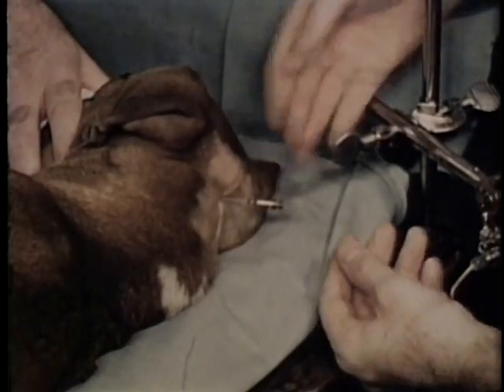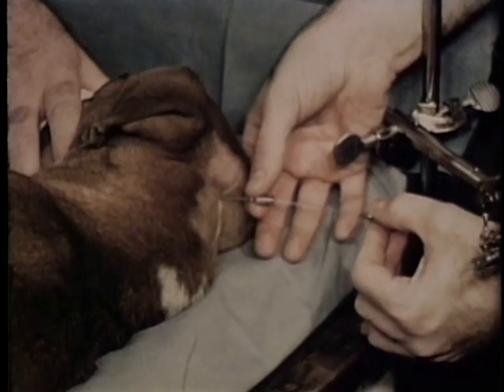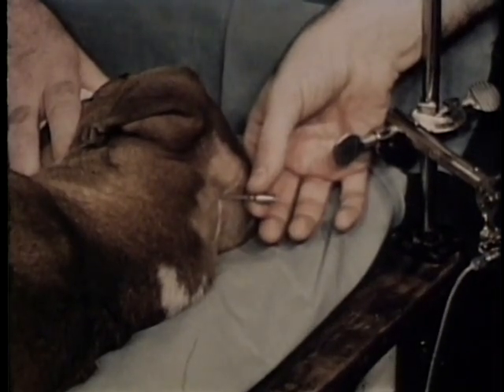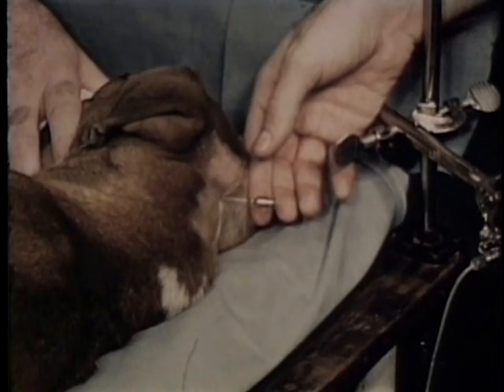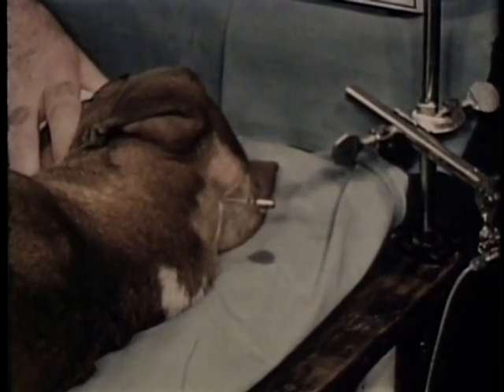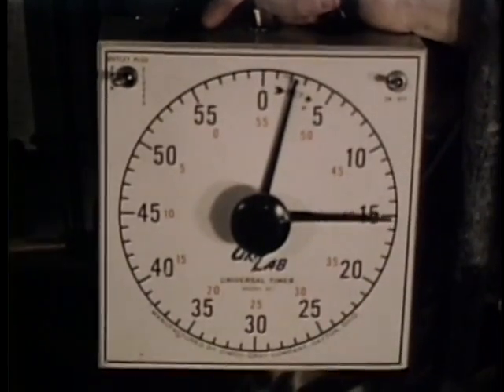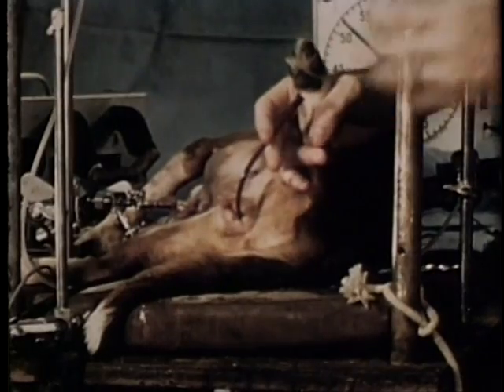Now the preparation is nearly completed. A puncture into the cisterna magna has been made, and the needle is connected to the strain gauge by a plastic catheter. Just before the onset of apnea, here, after 58 minutes of ventilation, the bladder is catheterized and emptied.